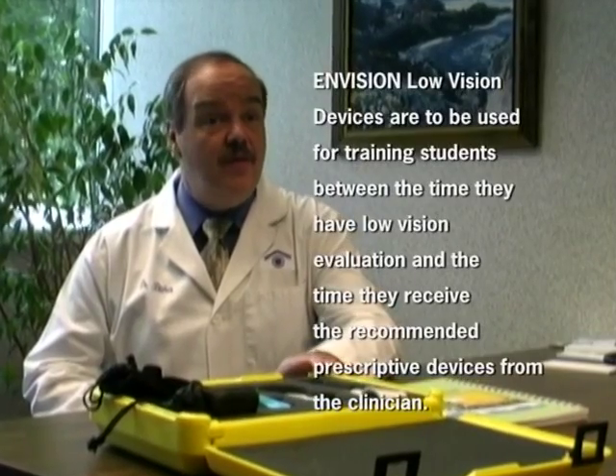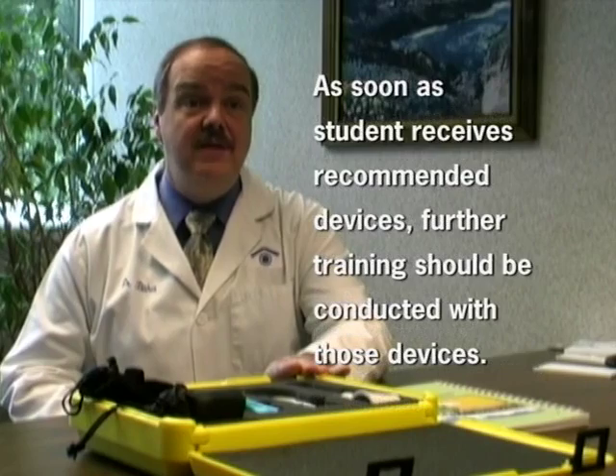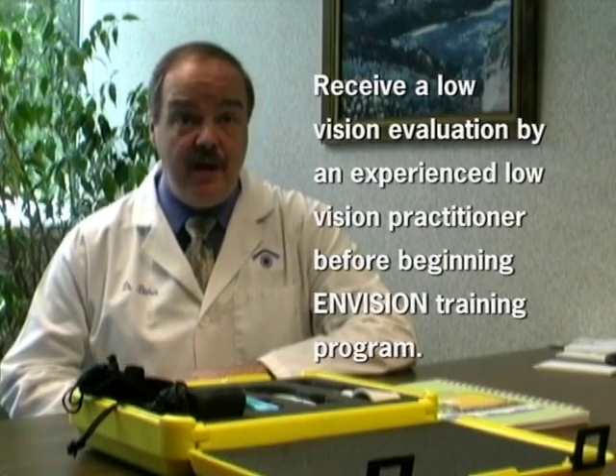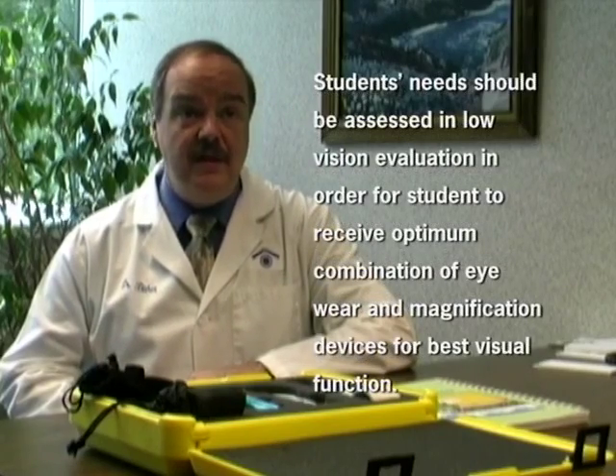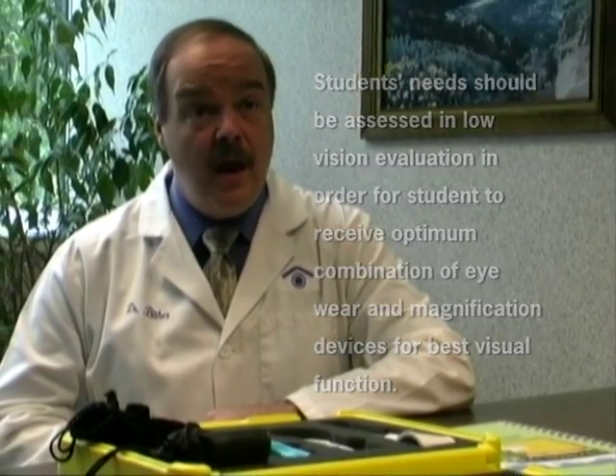Ideally, those working closely with the student in school and home environments will communicate back with the low vision clinician to report successes or difficulties with the recommended devices. The Envision program includes an array of low vision devices including magnifiers and monoculars, intended only for use in training students between the time of their low vision evaluation and the time they receive the recommended prescriptive devices from the clinician. I would like to emphasize the necessity of having a low vision evaluation by an experienced low vision practitioner before beginning a training program, so each student receives the optimum combination of eyewear and magnification devices.